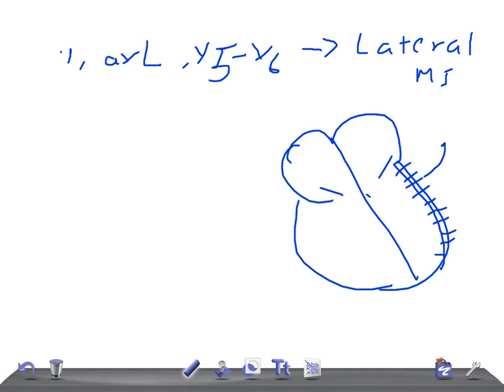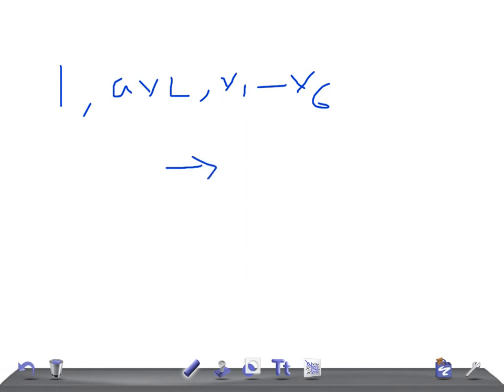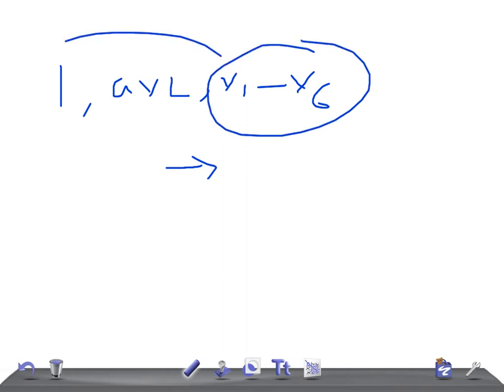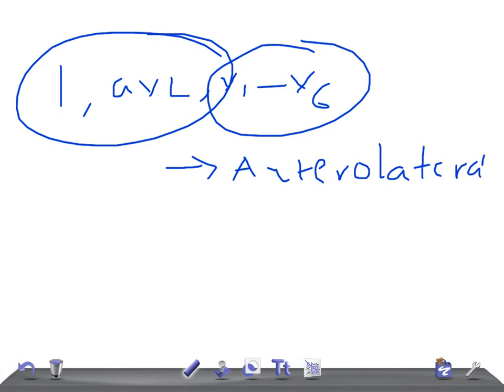Moving on: Lead I, AVL, V1 to V6. Earlier it was V5 to V6, but here it's V1 to V6. Where is the location of the myocardial infarction? This covers anterior and lateral, so it's going to be anterolateral myocardial infarction.